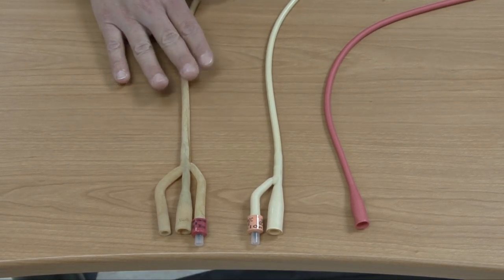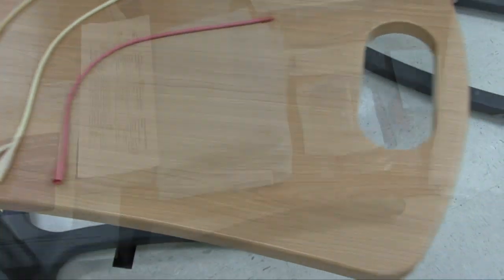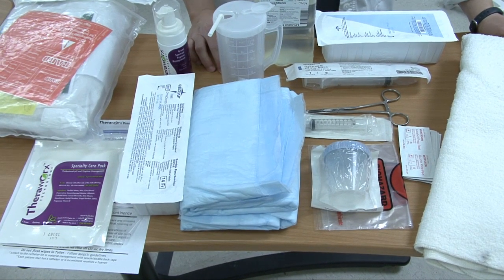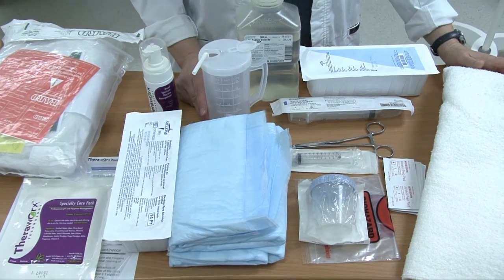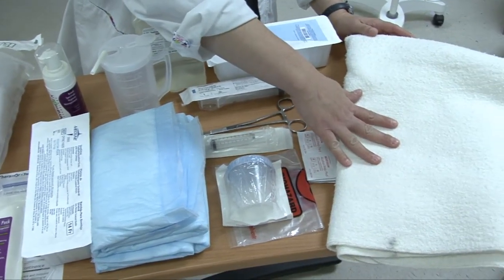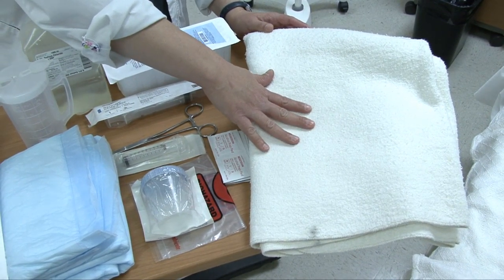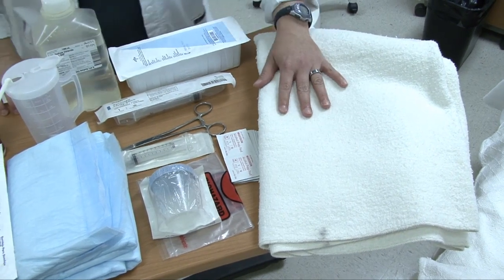Now I'm going to move over and talk about some other equipment you might need. While you are performing the catheterization, you always want to provide for privacy of your patient — we would close the door and close the curtain. You can see I have a bath blanket, or you might have other sheets. This would provide for privacy because your patient can get cold and you also want to keep them covered during this procedure.